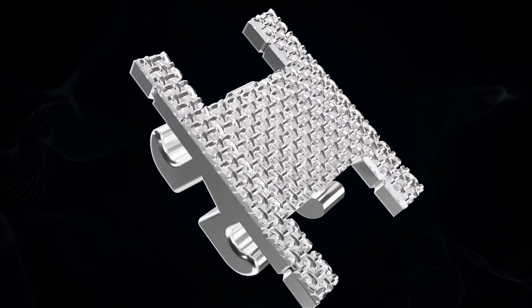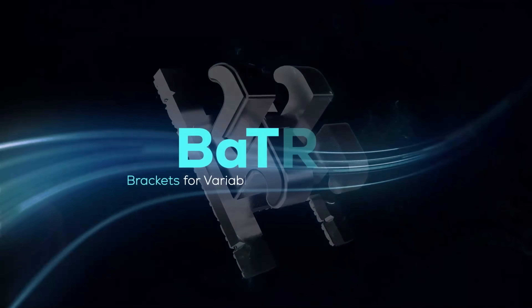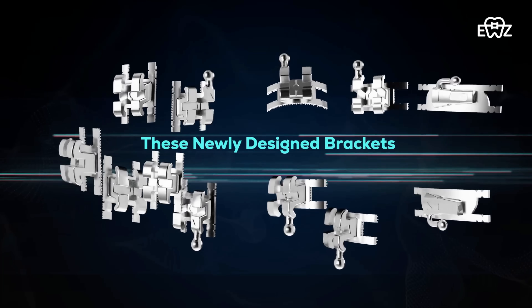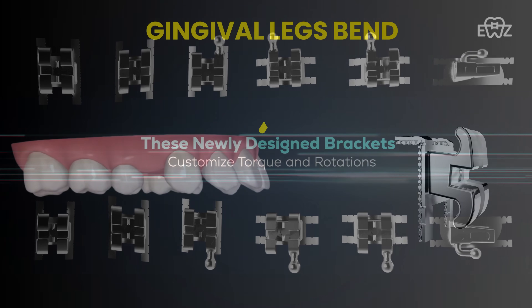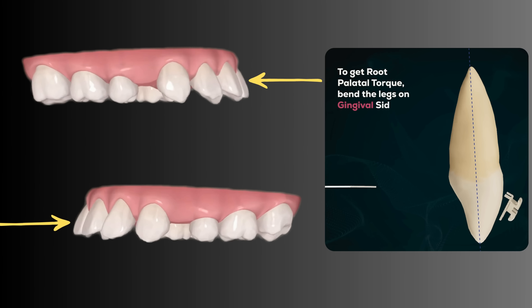The solution: BATR brackets for customizable root torque and rotations. We bend the gingival legs of the incisor brackets to generate palatal root torque.